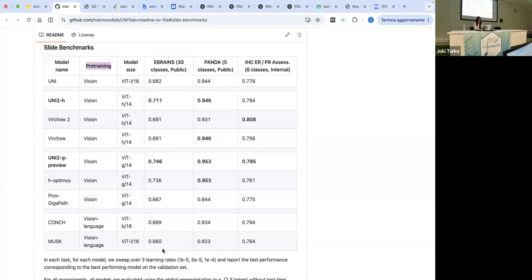So yeah. And also, I guess that right now the information from pathologists, like external annotation, is really important, because it gives us a sort of gold standard, or kind of a benchmark of whether we are doing well or wrong, of course.